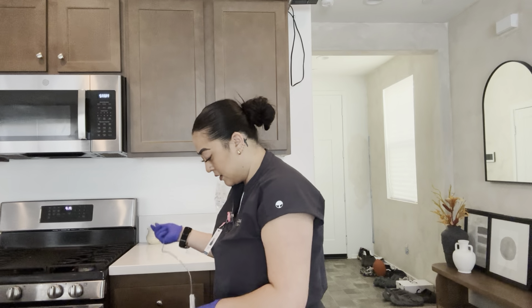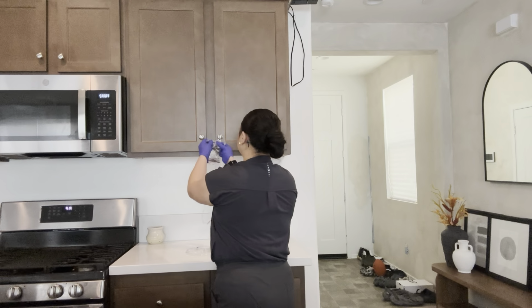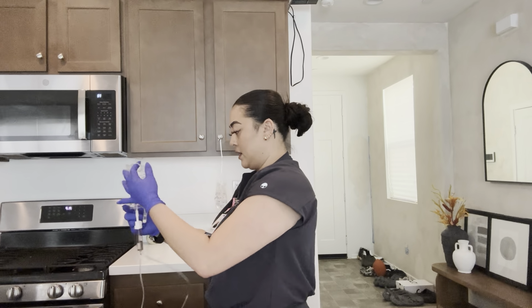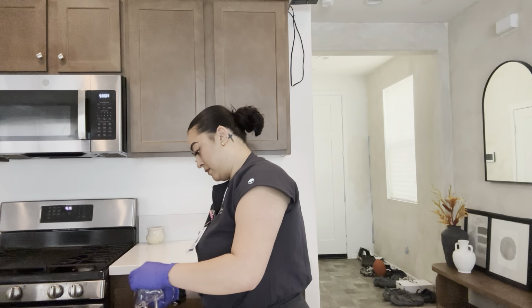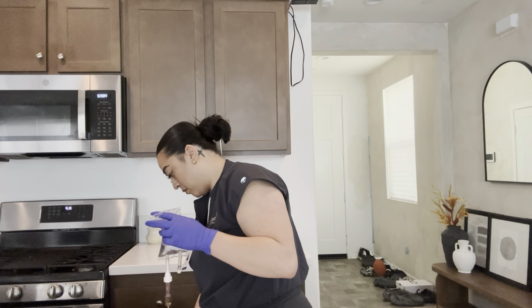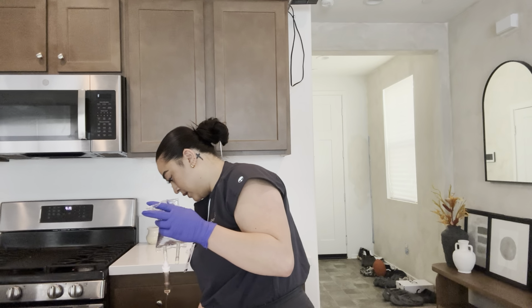So I have my clamp. Don't believe mine will reach, so I'm gonna actually have to do it right here as if it were above. Just ensuring that there is no air bubbles there.